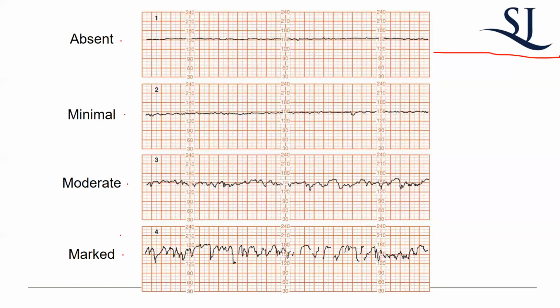We kind of make jokes about like that the baby's like really active, like raging and stuff, but this is something that technically would be referred to as category 2 because it's not moderate, but this doesn't really mean anything, or at least it's not directly associated with a pathologic condition. So don't worry about it. You got to be careful with this because you got to make sure that it's not just artifact that you're getting that's making it look like this. But really the ones you want to kind of look at are these 3, because that's where your decision making is primarily determined. Okay.